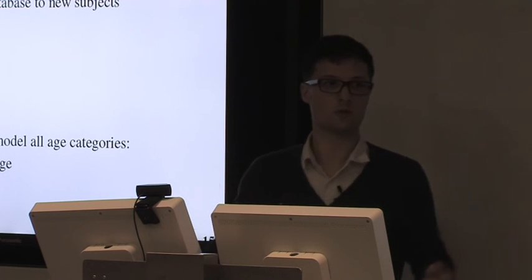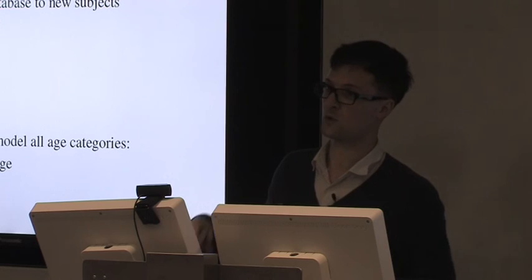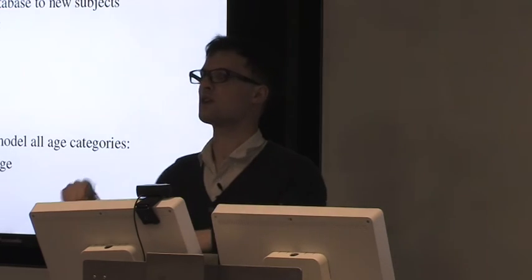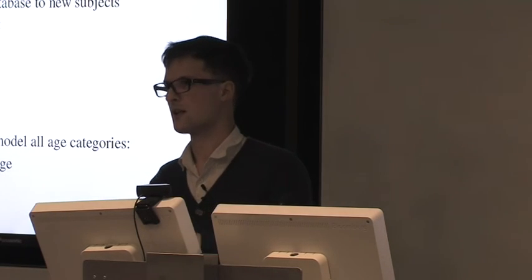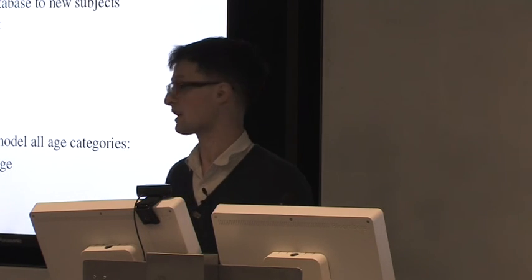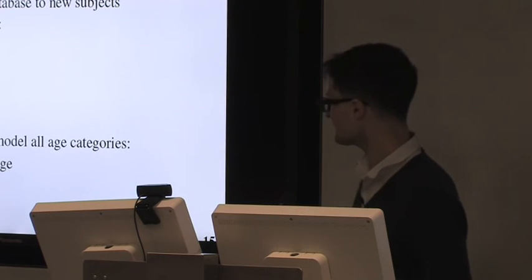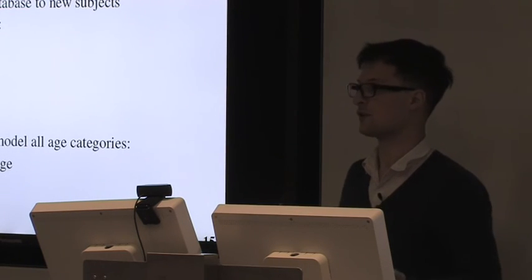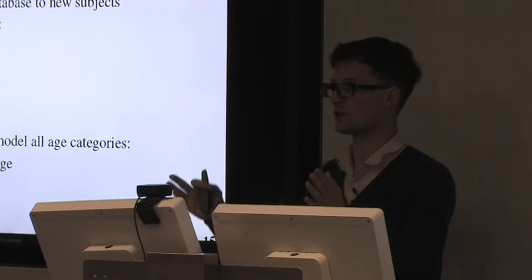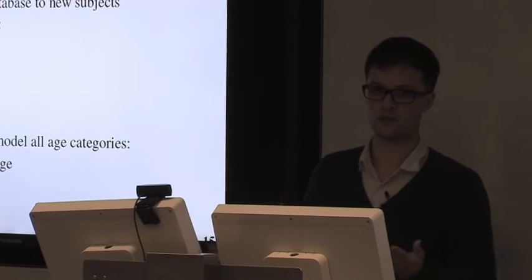Compared to other problems you might have heard of in machine learning, I've got to face the fact that I'm working on small data sets. What I'm learning on is actually the voxels. But in terms of fetuses, subjects, pregnant mothers that have been scanned, I only have roughly 50 of them. So what I did was infer the size of the things we are looking for from the age of the fetus, because we roughly know it when we scan the mothers.